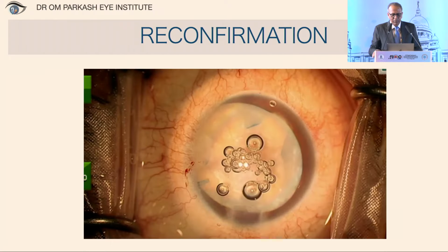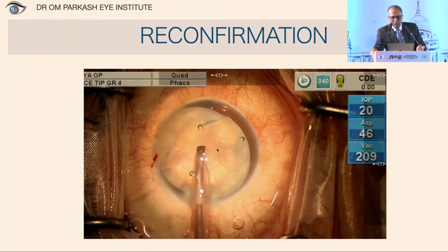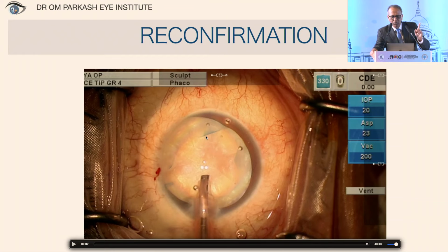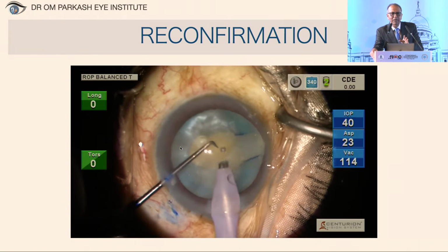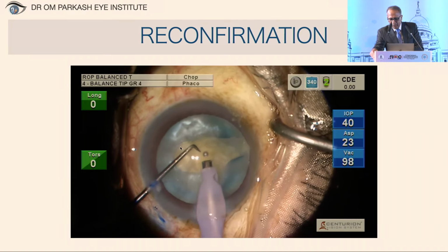Let's reconfirm. And how do we reconfirm? We just put it on irrigation mode and you find, can you see the flap fluttering? This shows that it is pre-equatorial. Let's reconfirm it again in another case. Again you will find the fluttering flaps. So this shows that it is definitely a pre-equatorial flap.